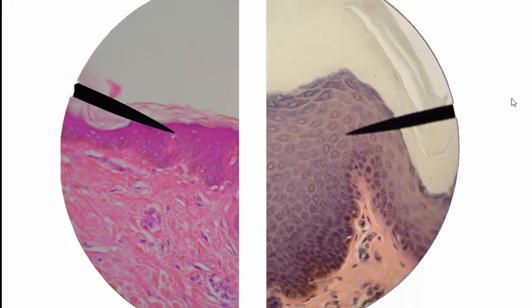This is a nice image with a side-by-side comparison of thick skin and thin skin. Thick skin, again, is on the right, and on your body where you find thick skin is on the palms of your hands and the bottoms of your feet. Thin skin's on the other side. And we could talk about the major layers.